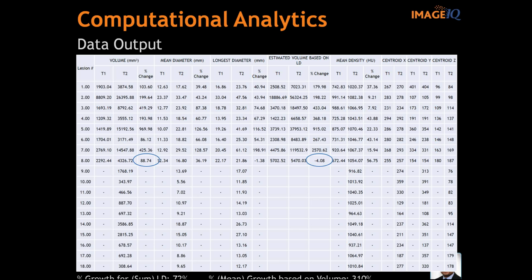So you might ask, what are some of the technical requirements for doing a software-based assessment for nodule assessment? One of the things I alluded to before is to try to get consistent breath hold between time points. Have a consistent image acquisition protocol, and I'll cover some of the key parameters that you want to look for and make sure they're controlled a little bit later on. Have calibrated systems with continually monitored image quality.